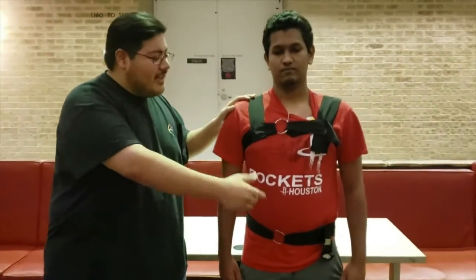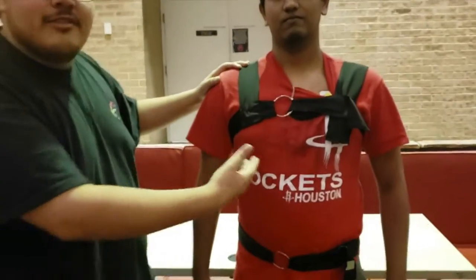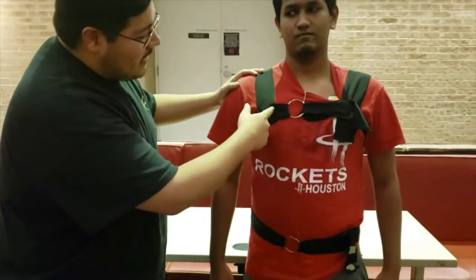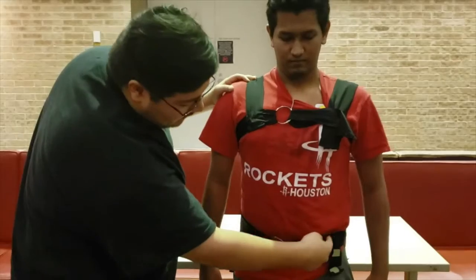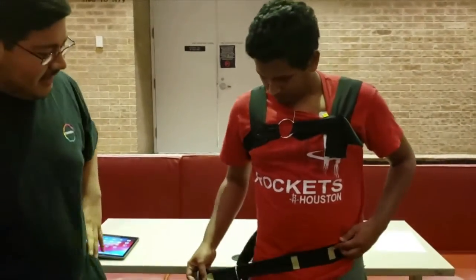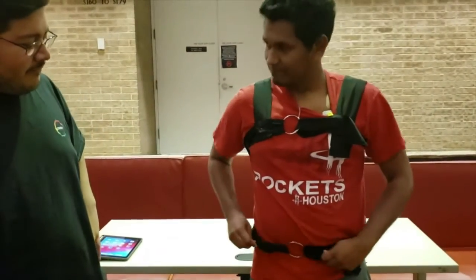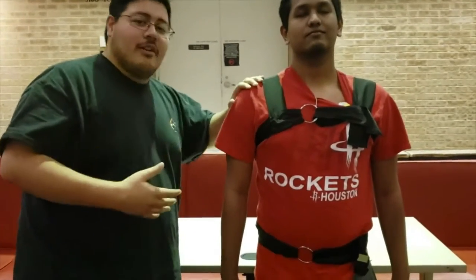Here is the wearable that we created. You can see it's made out of stretched fabric with Velcro so that it can fit whatever person's body size. One electrode is attached right here, another electrode is right there, and another electrode is right here. Ideally this would go under the shirt and you can put a shirt over the person.